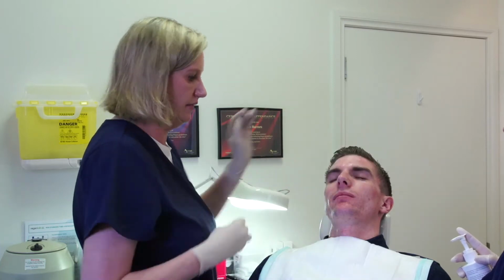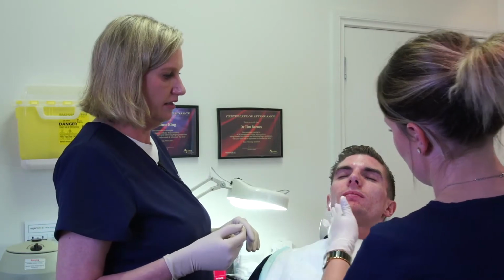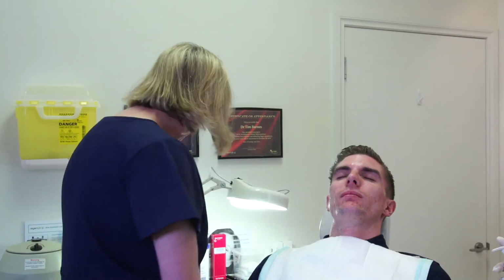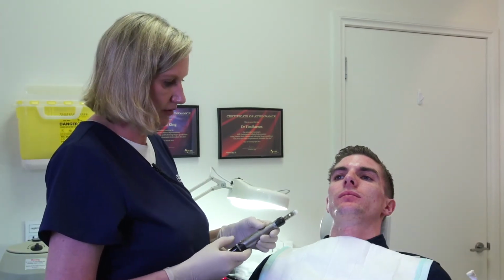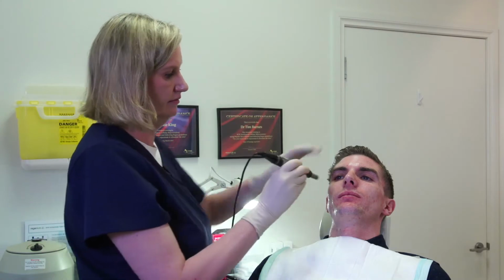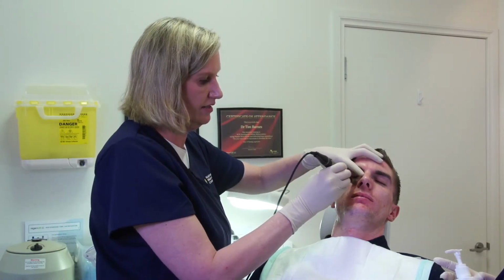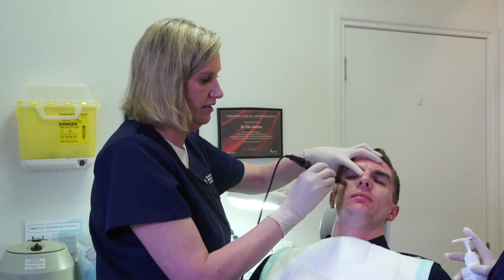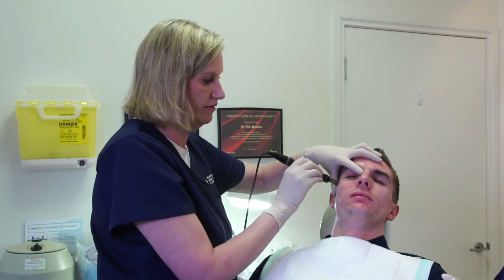All right. Okay, Holly, so we're going to put some hyaluronic acid gel on to help the pen glide easily. We'll start with a depth of 0.5 and a speed of 4. And always remember to take the cap off. Keep the skin on a stretch when you're doing your Dermapen. And just like we do with our derma rollers, 3 different passes.